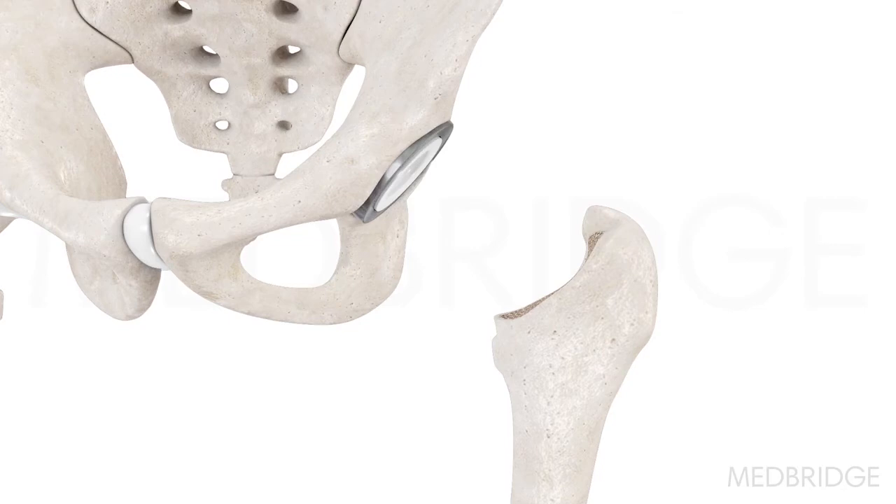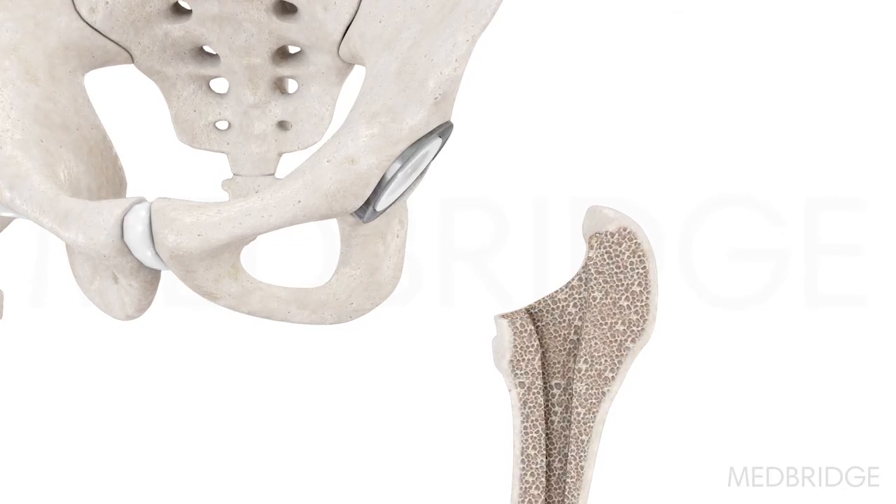The femur is hollowed out to accept the stem of the femoral component. Cement may or may not be used to fixate the femoral stem.